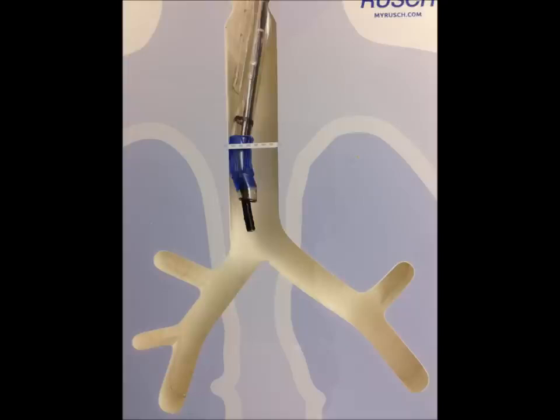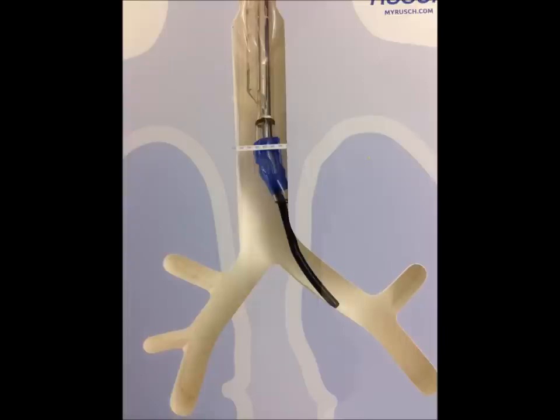That's an incredibly unusual operation for our hospital. You might get one of those every 5 years. It's usually a lobectomy, or usually doing something where you just need the lung down for a little bit. But anyway, go down the left endobronchial lumen, visualize the trachea carina, and from that point you can see clearly that the endobronchial and the fiber optic scope needs to go down the left. Visualize the bronchoscope moving down the left.